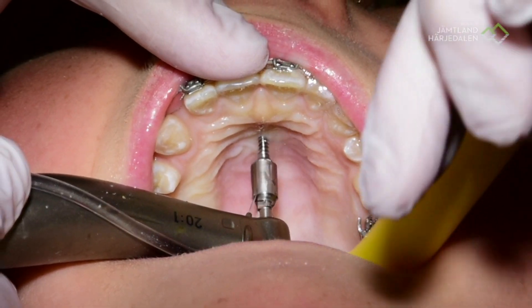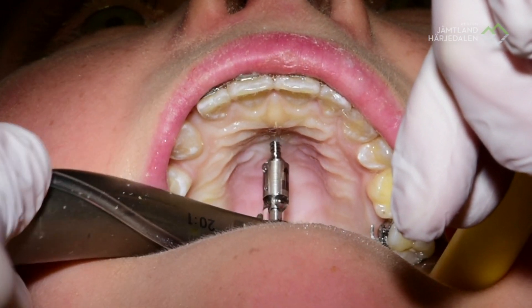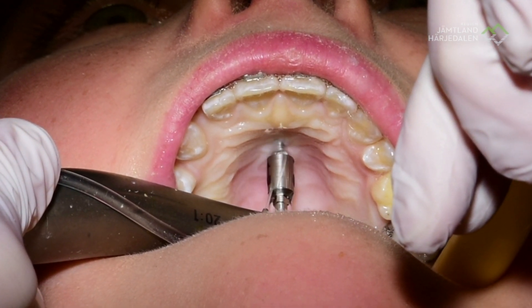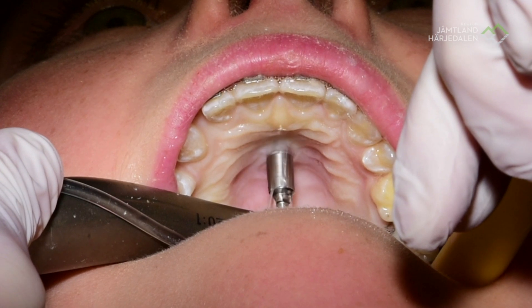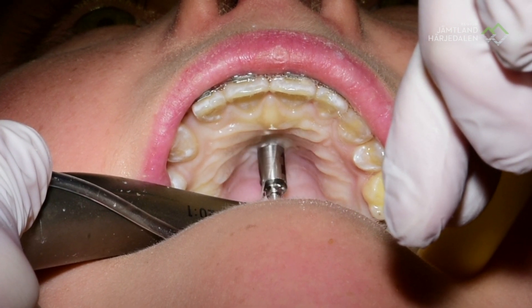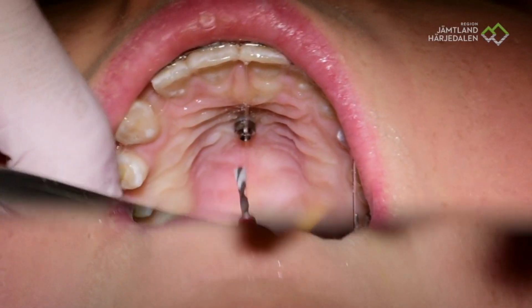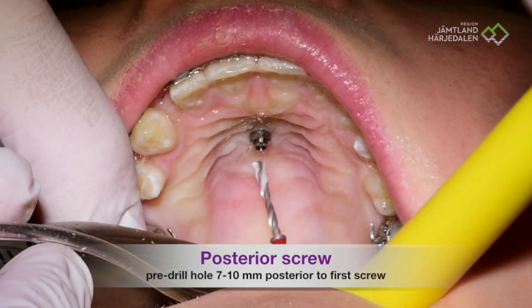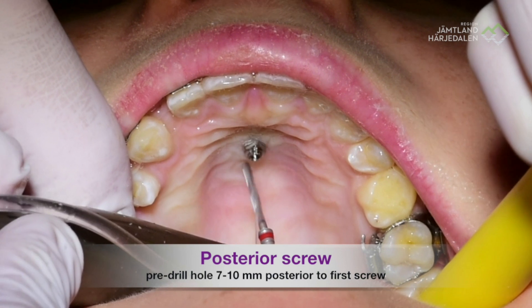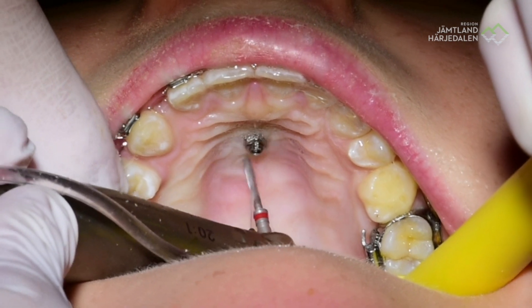Then we will continue — you will feel the pressure now. Can you feel the pressure a little bit, especially on the frontal teeth? Now I am almost finished, so then you get the tickling in the nose: one, and two, and three. Seven to ten millimeters, seven to ten millimeters. I am counting to three: one, two, and three.